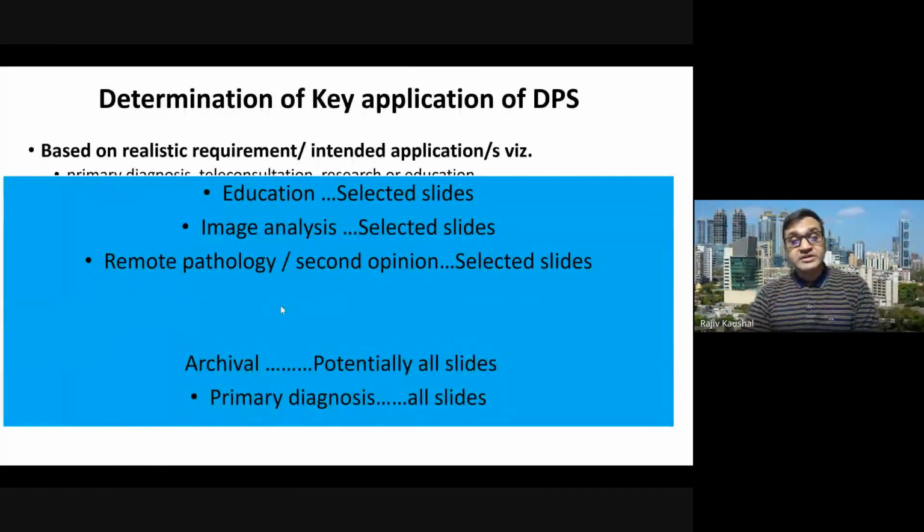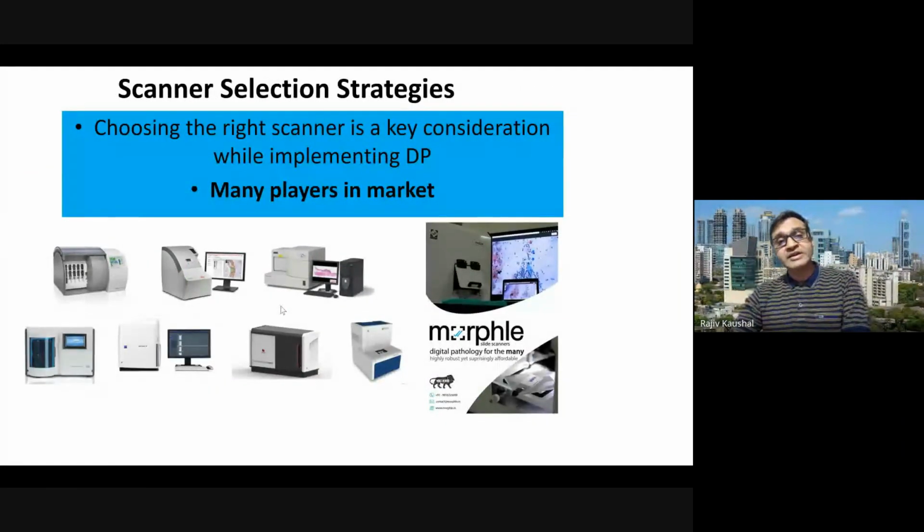Even the type of slides which you use also depends on the intended use. For education, image analysis, or some research, you can use selected slides for scanning. But if the intent is primary diagnosis, then you have to scan all the slides.